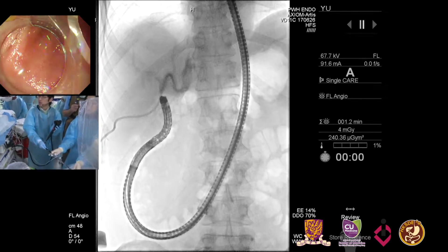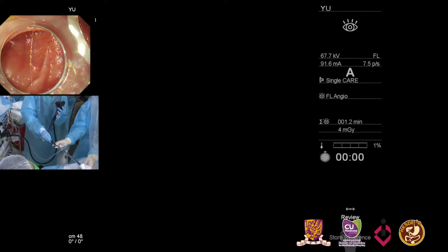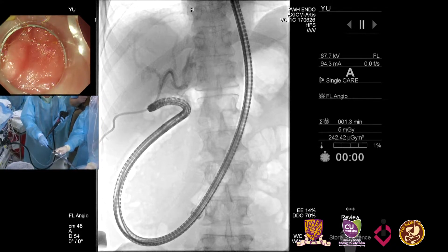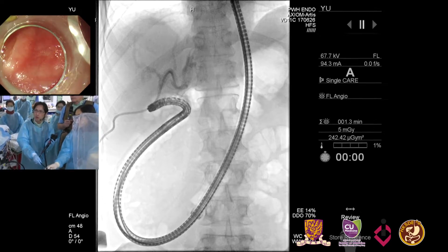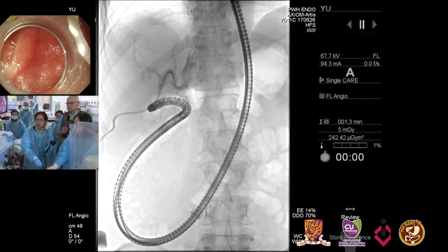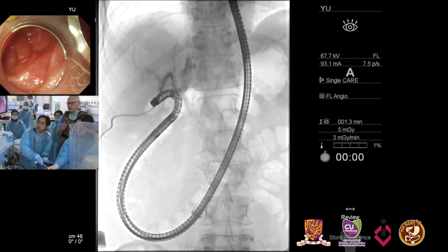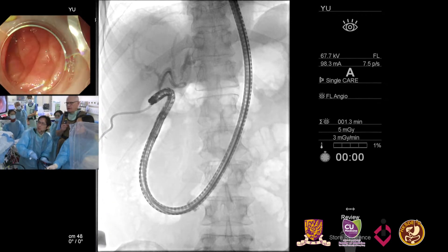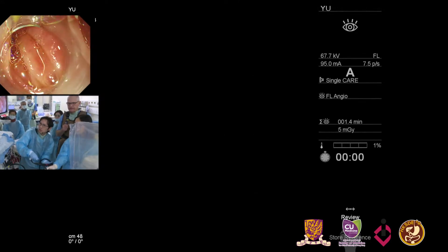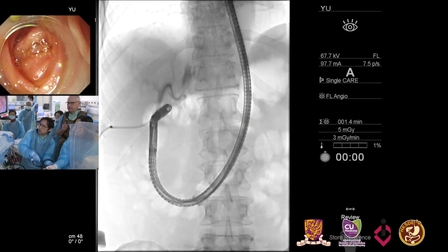I'm wondering — does the balloon enteroscopy help stabilize your scope, or does it soften the route to allow you to go in deeper? I think both. For stabilization the overtube helps, but sometimes patients have a long afferent limb after a Whipple's and we couldn't get there with the pediatric colonoscope due to looping — the overtube helps in that sense. Notice also that Raymond has a cap on, which is our practice as well. Fluoroscopically it looks like we just have a very tight bend and then we'll be there — it's always the last tight bend that's a problem.